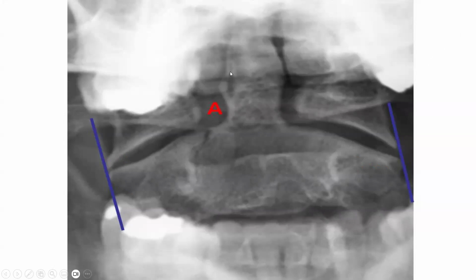So this one is type 1, this one type 2. The patient has a fracture here and a fracture here. But the edge, is it the same line or not? I'm talking about the alignment. Same, normal. It means no fracture in C1. Clear? Yes, sir. The fracture is only in the C2, the dens odontoid fracture. Clear, doctor? Yes, sir.